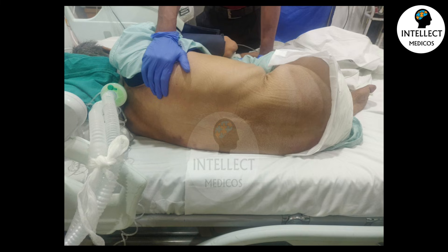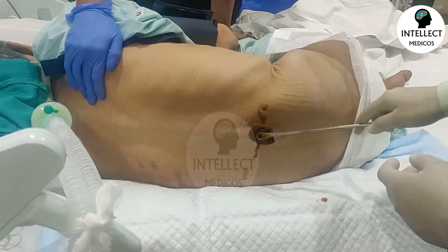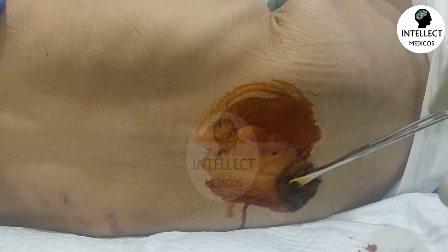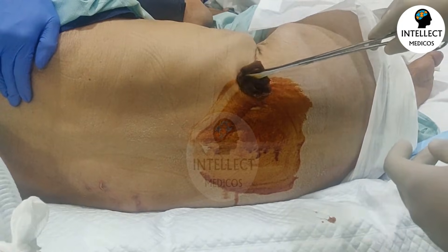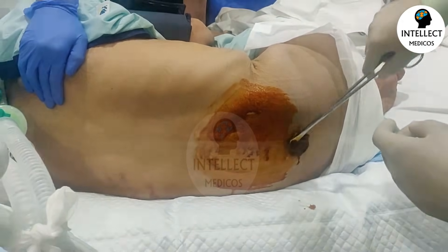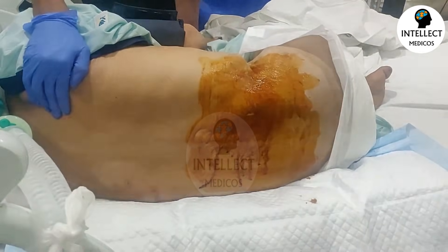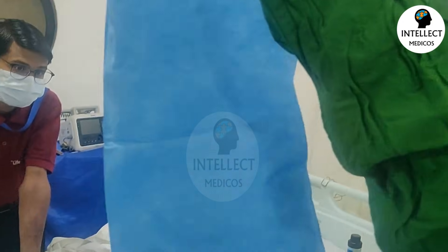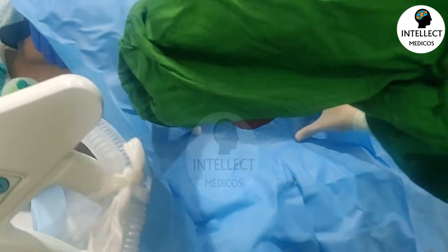Before cleaning, check the site for infection. Draw an imaginary line between the two highest points of the iliac crest, which corresponds to the L4 vertebra - that is where you start cleaning. Clean the area with gauze dipped in chlorhexidine or betadine in a circular manner, two to three times, covering below the scapular area down to the gluteal line. Then drape the area with a sterile sheet with a circular cut in between, and let the chlorhexidine or betadine act.